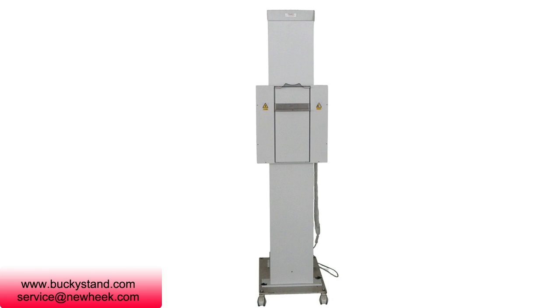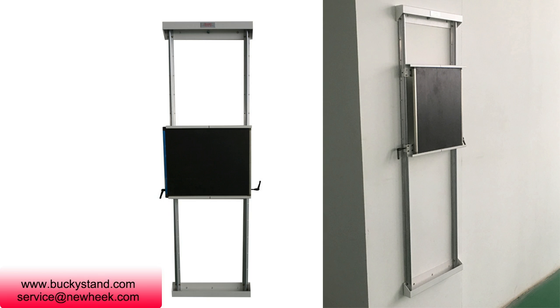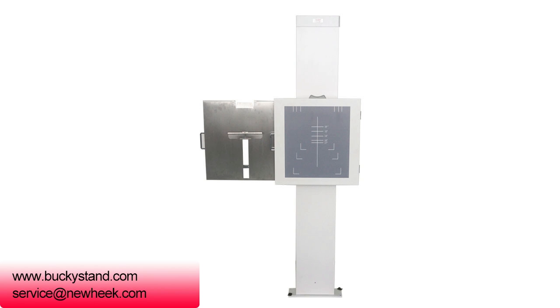The device consists of a bucket tray set, a pair of tracks, and a balance device. It is applicable to different sizes of normal x-ray cassettes. See our cassette and flat panel detector specifications for further details.